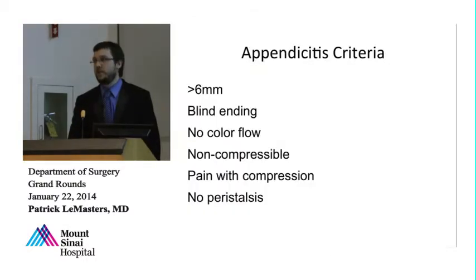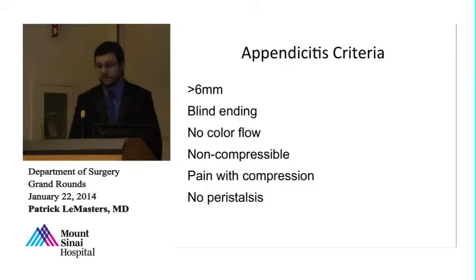So what is the criterion we use? 6 millimeters. It's blind ending. There's no color flow. It's non-compressible. There's pain with compression, and there's no peristalsis within it. So let's look at these.